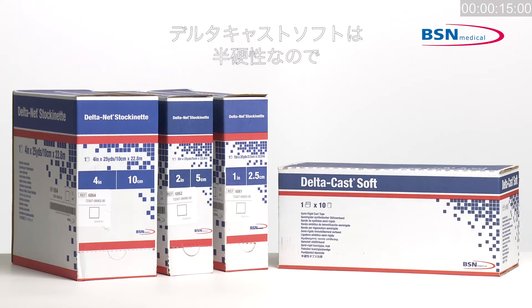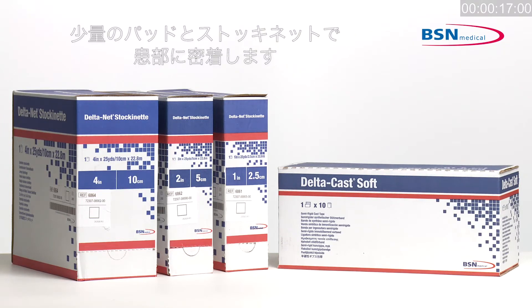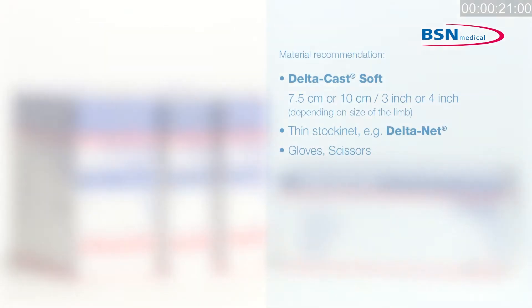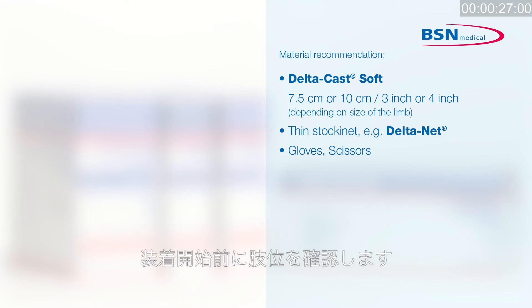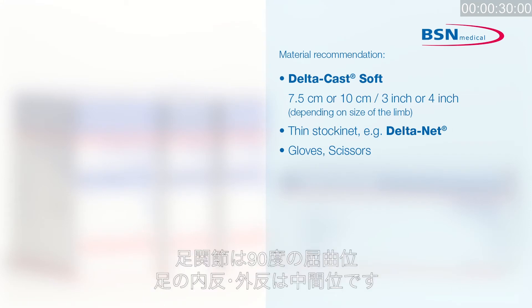Due to the semi-rigid properties of Deltacast Soft, only minimal padding with a thin stockinette is required and allows a snug fit. If the patient has prominent bony areas, extra padding may be required. Define the position of the limb before start of application. Ankle flexed to 90 degrees and the foot in neutral inversion-eversion.